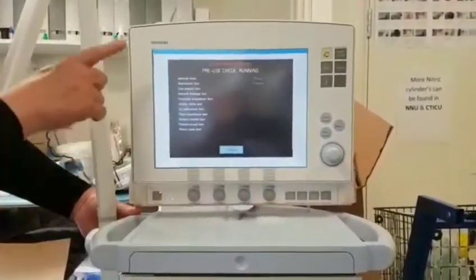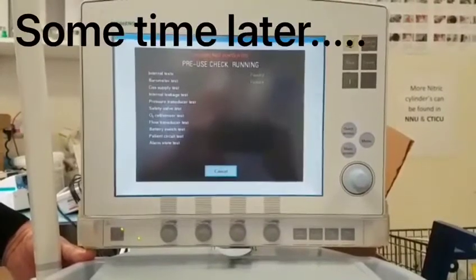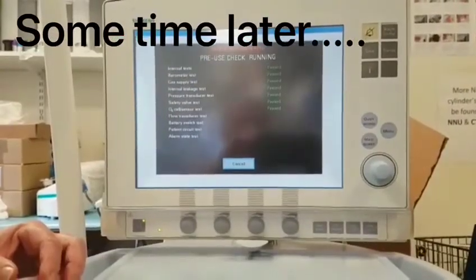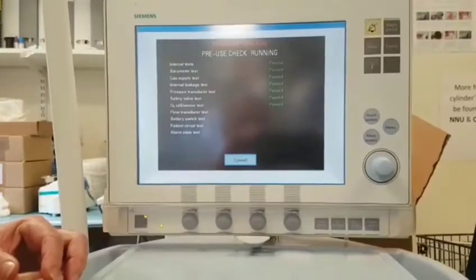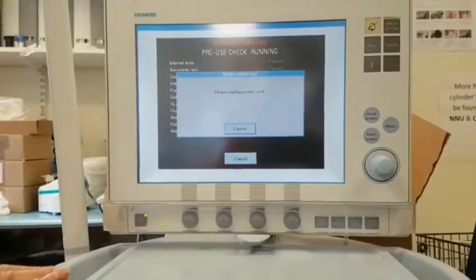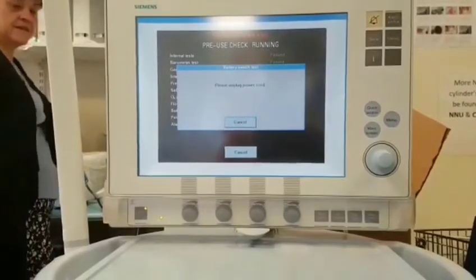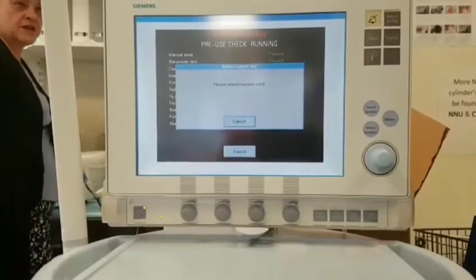You can see as it's doing its tests, it has a green pass next to them. Now it's asking me to unplug the power cord, and then it will ask me to reinsert the power cord.